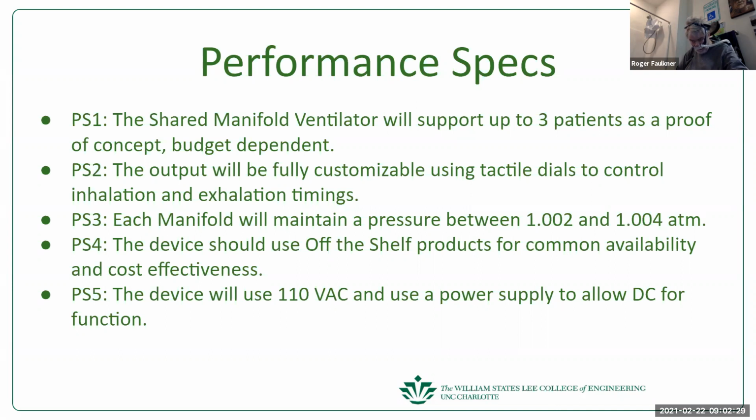I assume that you'll be getting close to the target pressure by a little bit above, because you don't want to be opening and closing a valve against 15 psi if you need a quarter of a psi. You see what I mean? Right. That's the finer point. I'm sorry.